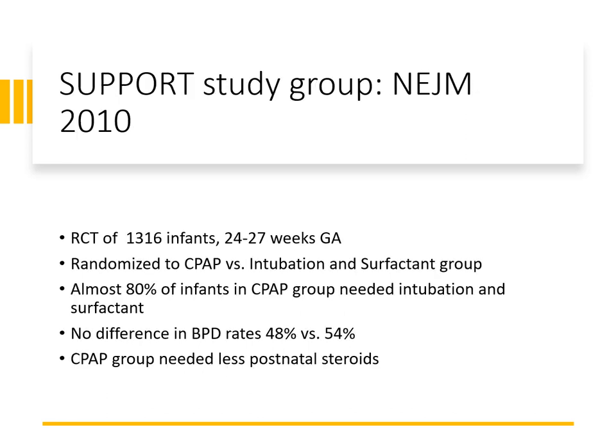The SUPPORT study group, this came out in 2010, and this was again a big study. Again, very small infants, 24 to 27 weeks. But here in the CPAP group versus the intubation and surfactant group, almost 80% of the CPAP group required surfactant. There was no difference in BPD rates. They were the same, but the only thing was the CPAP group needed less postnatal steroids.